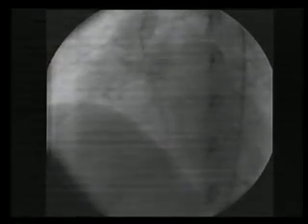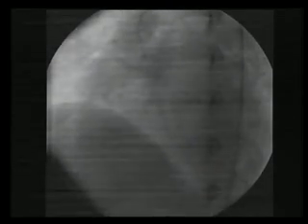The beauty of this procedure is its simplicity. If you look at the original reports on VSD closure, you have to create an extensive arteriovenous loop to go ahead and approach the VSD in trying to close it. But if you look at this, it's a direct access to the VSD and everything is done through the arterial route. And the whole procedure seems to be quite short as far as the procedure time is concerned.